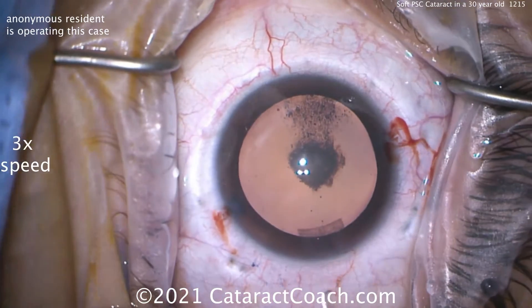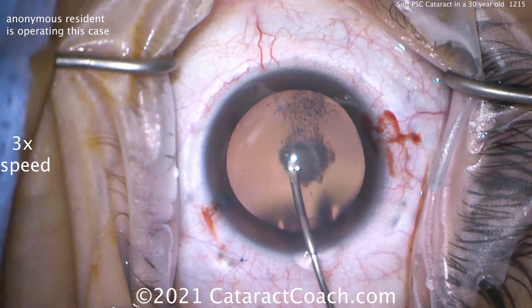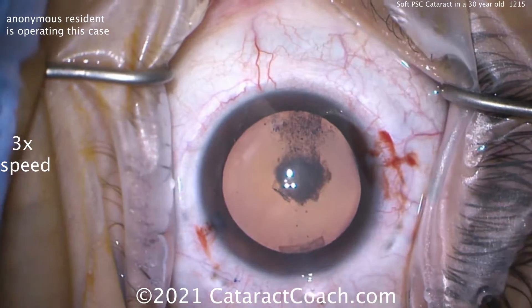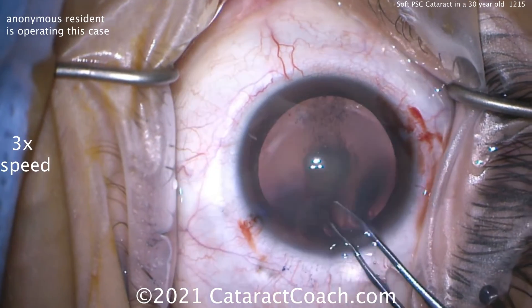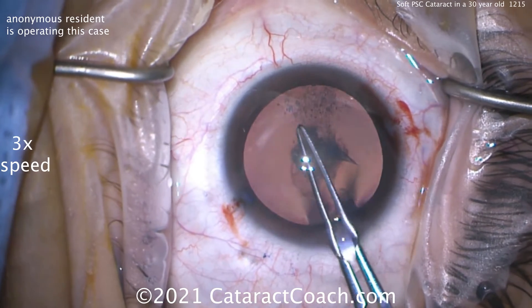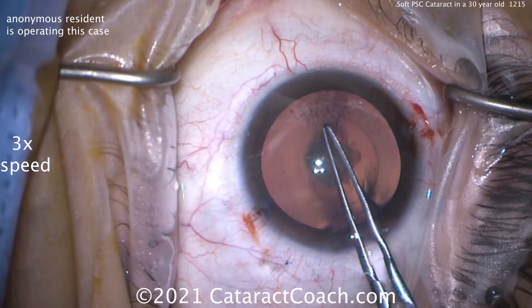Here comes the rhexis. The capsule will be a little less elastic due to that Trypan Blue dye that went in the eye, and that's just a side effect that's very helpful for us to take advantage of. But otherwise, in a 30-year-old, this lens capsule is going to be very elastic — very different than your average 60- or 70-year-old. So make sure you get a nice, good, secure capsule rhexis. Aim for about a 5-millimeter capsule rhexis.